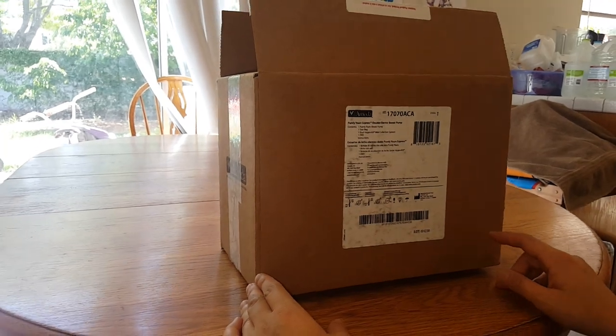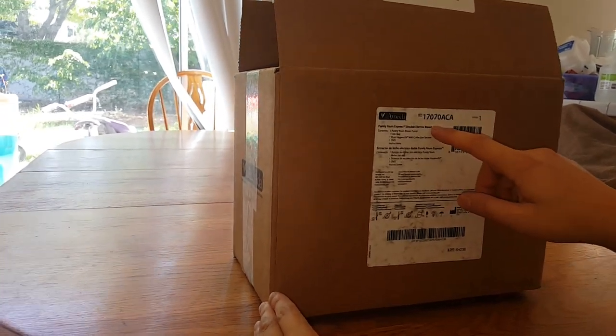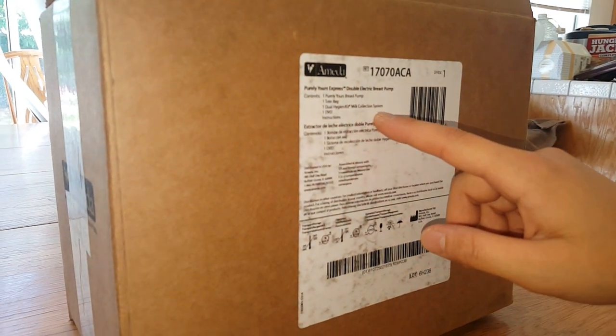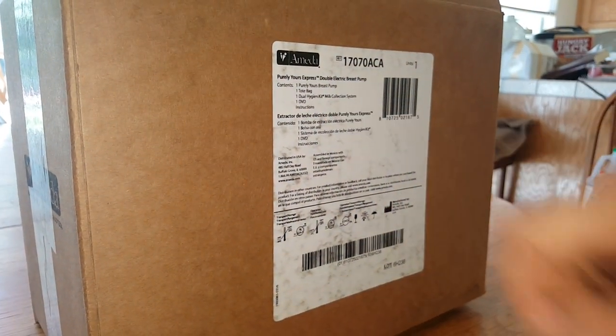Here are the contents. We have one Purely Yours Breast Pump, a tote bag, a dual hygienic kit, a milk collection system, and a DVD for instructions.